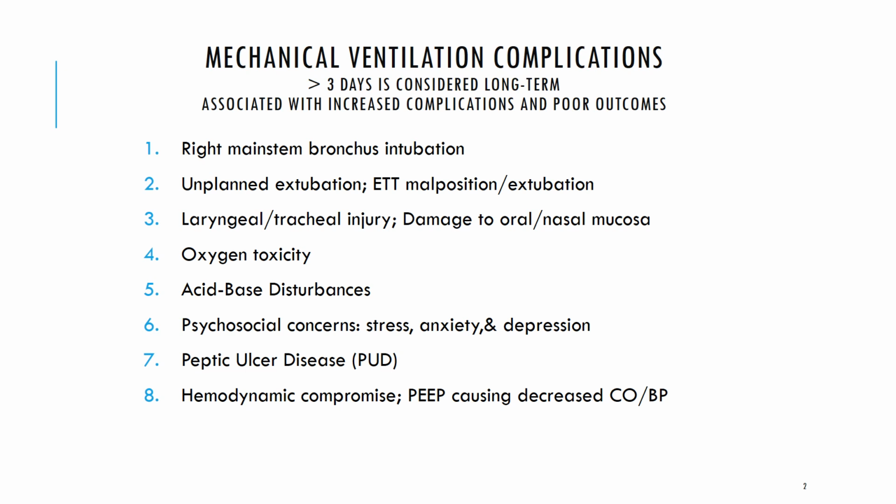Now, a little bit of pressure might be okay, but what if we had to turn up the PEEP for a patient, let's say up to 20 centimeters water? This patient's really, really sick. That's a lot of constant pressure in the intrathoracic cavity. And that's basically counter pressure on the heart that is trying to fill up before it contracts. But it's pretty hard for that heart to fill up if something is squishing it and pushing it down.